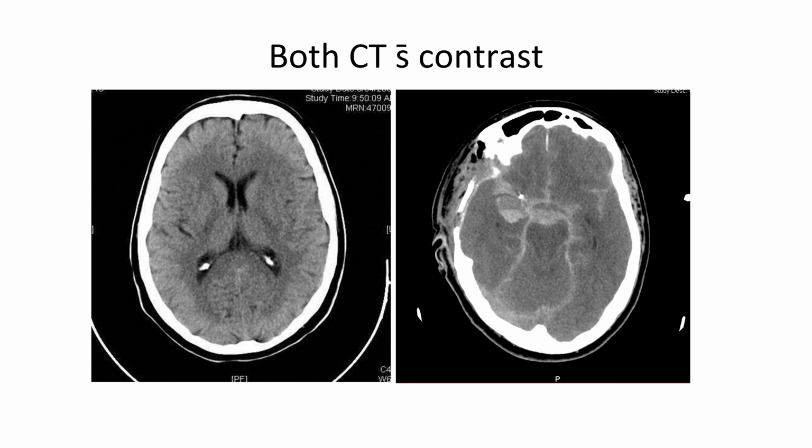And I put this up simply to remind you not to be confused that just because there's blood there filling these cisternal spaces, don't confuse that with contrast in the vessel. This is not contrast in vessels here. Both of these are CTs without contrast.